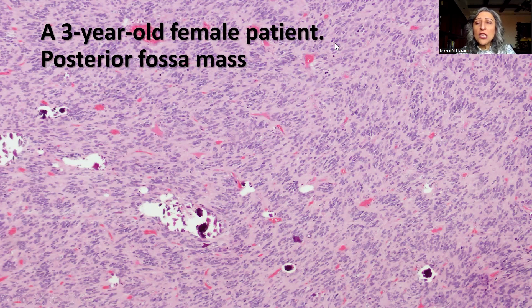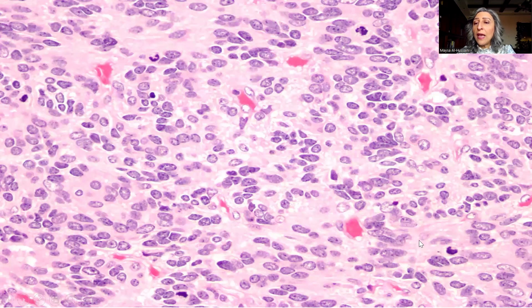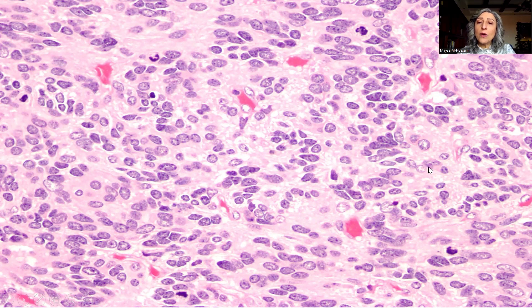The low-power magnification might give an impression of ependymoma. On slightly higher power magnification, what first catches the attention is the abundance of mitotic activity seen throughout the tumor. This is a mitotically active tumor.